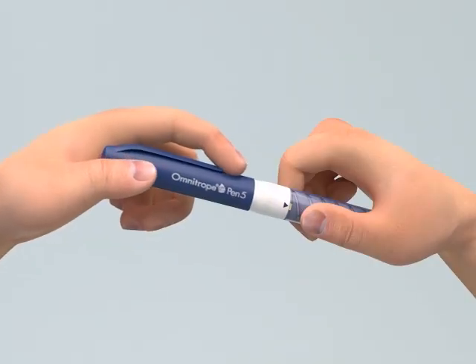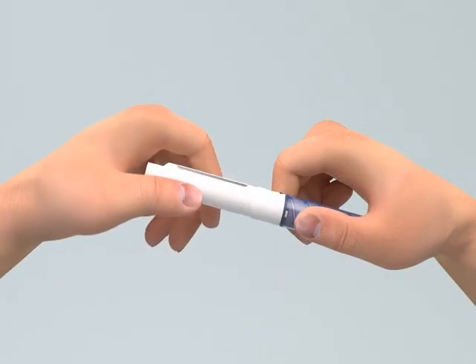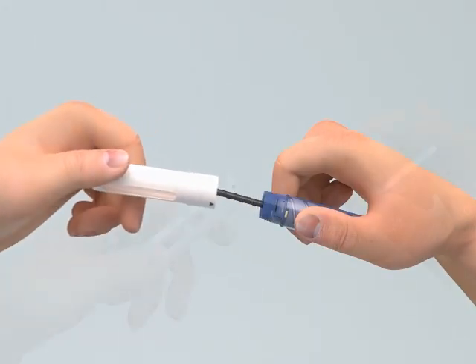Start by removing the pen cap by pulling it off your pen body. Holding the pen body, unscrew the cartridge holder and remove from the pen body.